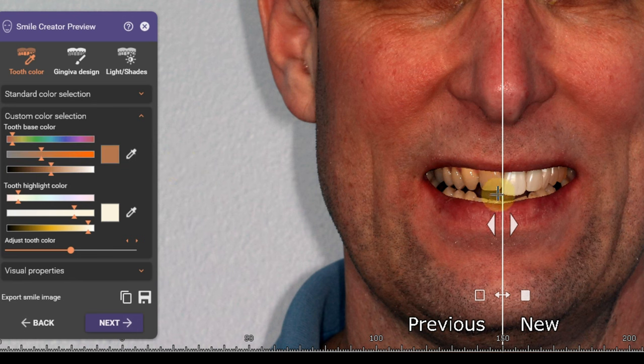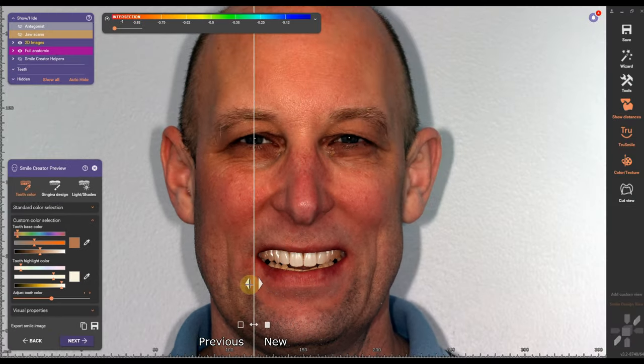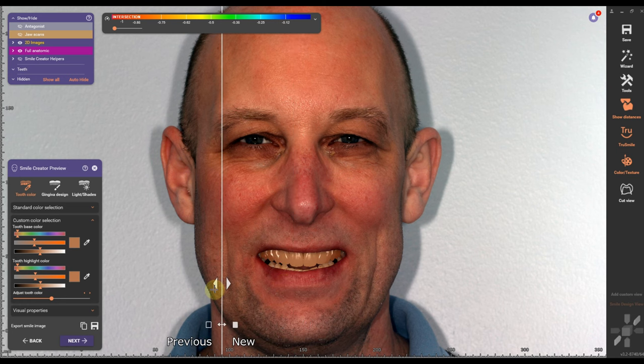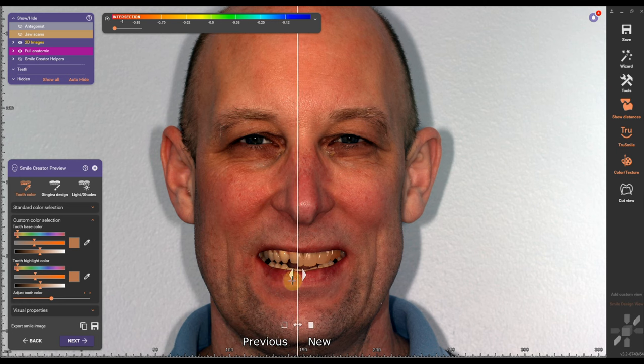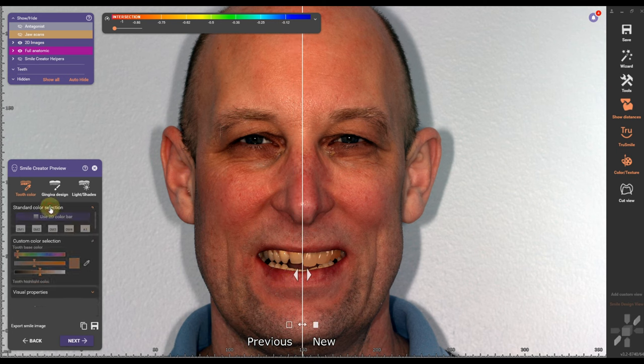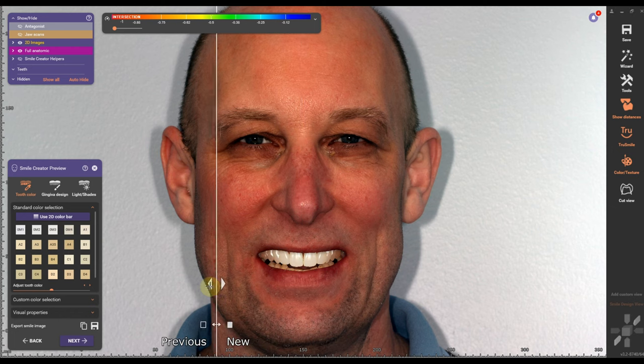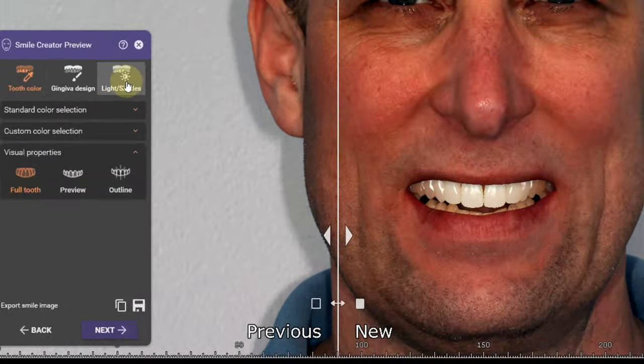With this method — the emotional mock-up — you can actually see how you're going to look with wider teeth, longer teeth, or shorter teeth. That makes it perfect for communication between the lab and the doctor, but also between the doctor and the patient.